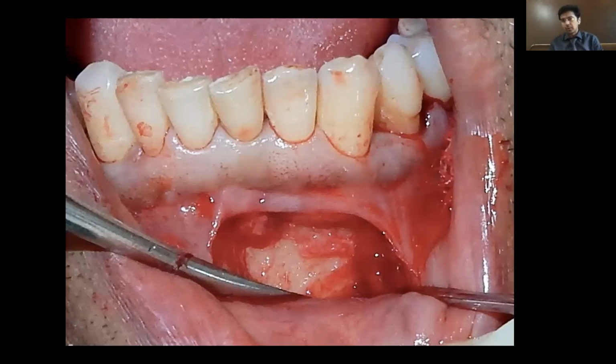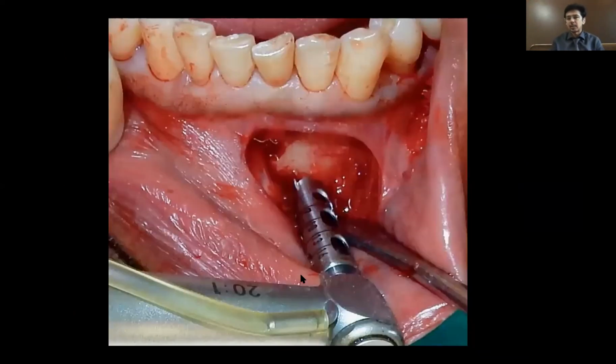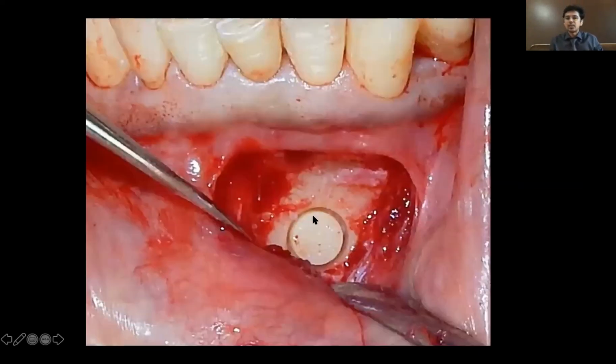For procurement of the autogenous graft, you need to buy an instrument known as a bone trephine. So this is the 5 millimeter bone trephine which I use, of Amaron. This is for 5500. You use it between 100 to 200 RPM. It shouldn't be too fast. And once you are doing the drilling, the moment you have gone through cortical bone and reached the cancellous portion of the bone, a dip would be there. You'll be feeling as if your instrument is slightly dipping, very slight. This is when you have gone through the cortical bone. So this ring would be there.